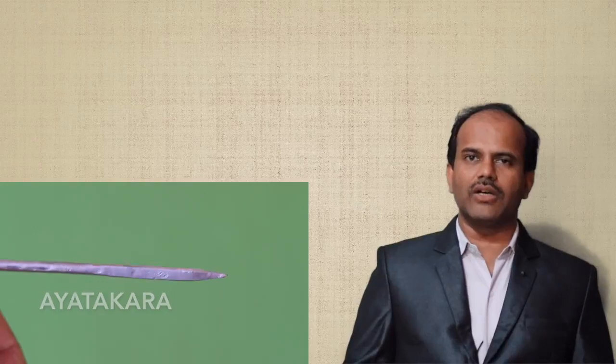In the photograph you are seeing now in the video, for demonstration purposes I have prepared this needle-like structure, which has 4 surfaces. You can see in the video here, it has 4 surfaces, an eye and a tip, which is nothing but the cutting needle.